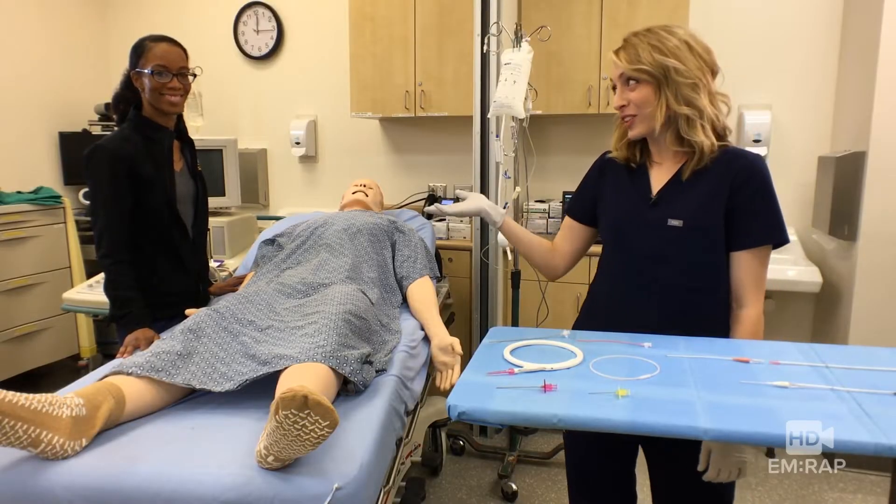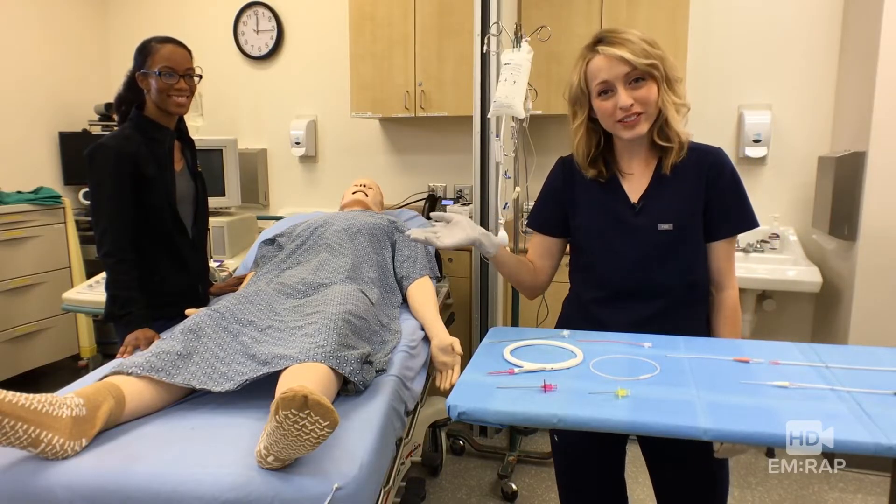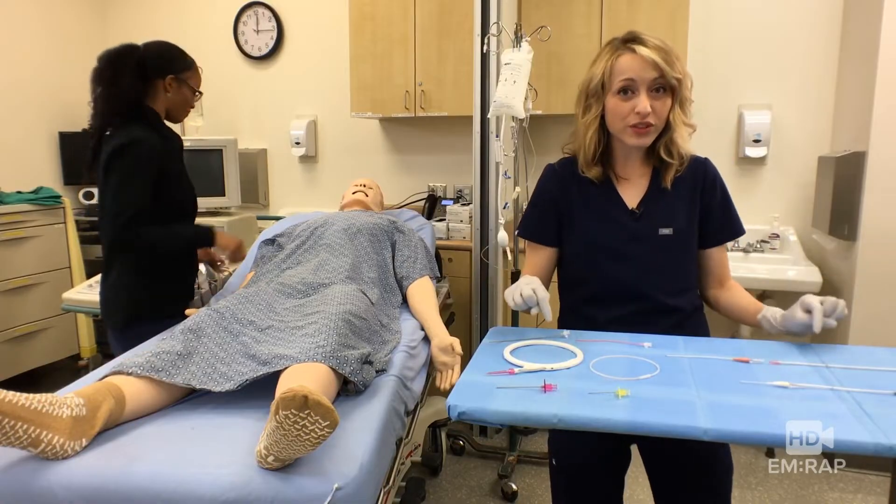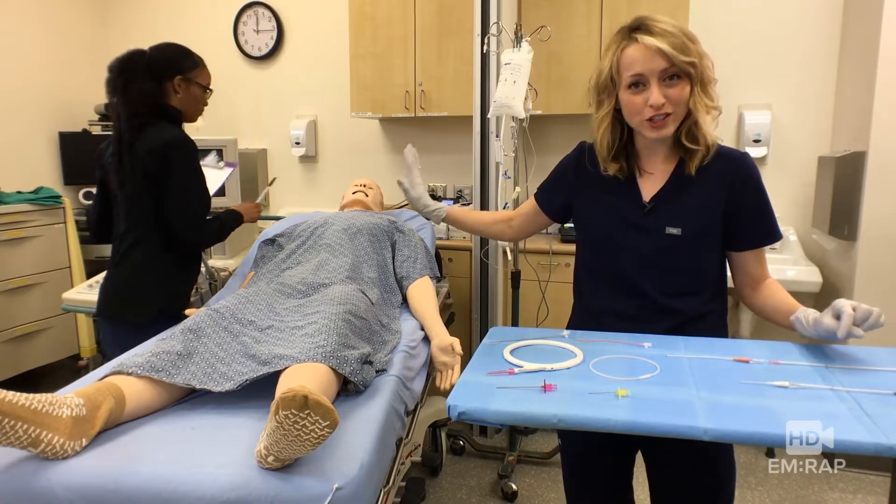I'm Dr. Jess Mason, this is Dr. Whitney Johnson, and we are going to place a femoral arterial line for this hypotensive patient. First, let's review the equipment that you need while she gets the patient consented.